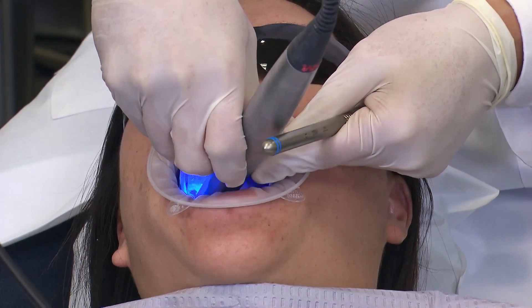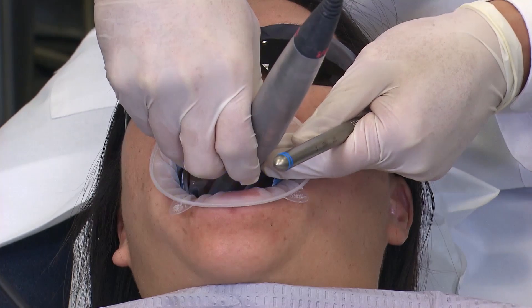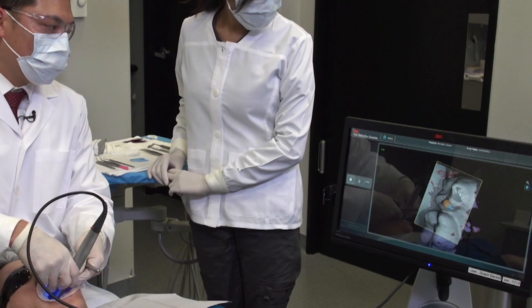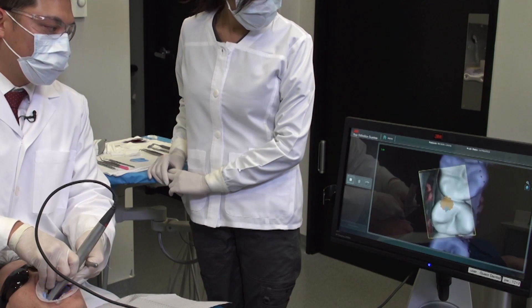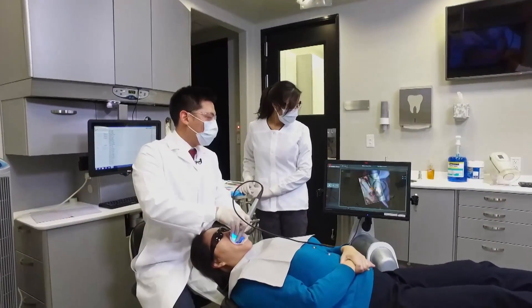The working distance for the 3M system is about 3 to 17 millimeters. You can see in the center of the screen the orange circle — that is an indicator for whether or not you're in the correct depth of field. I now have the upper right quadrant scanned in.